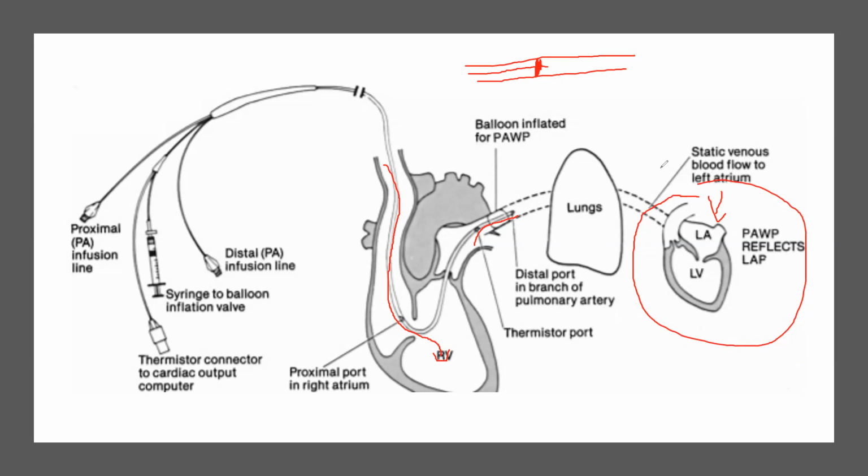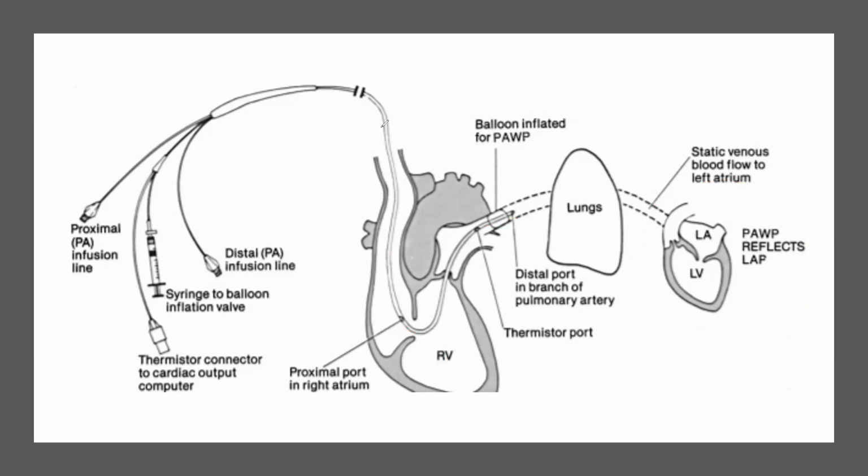Let me repeat that because that was a mouthful. Now, remember that this catheter is going to go from the right atrium to the right ventricle.